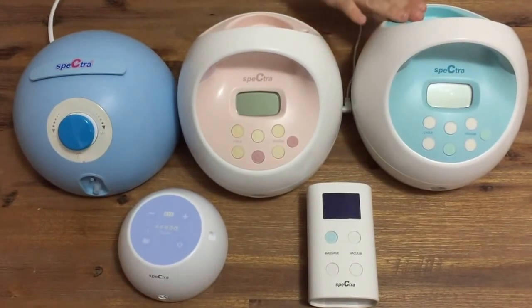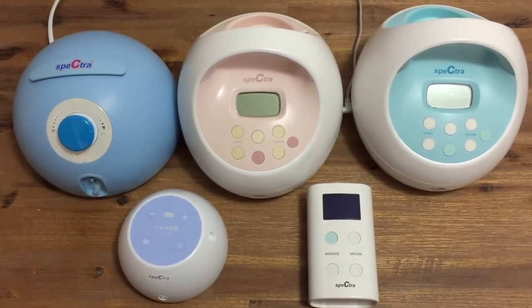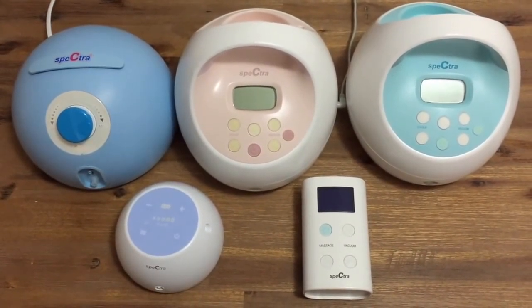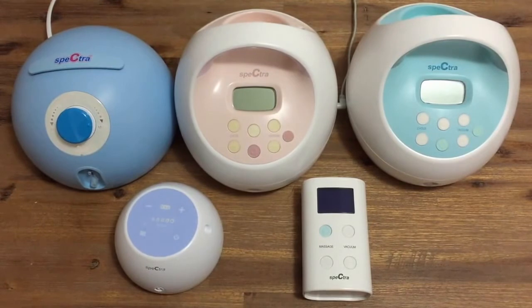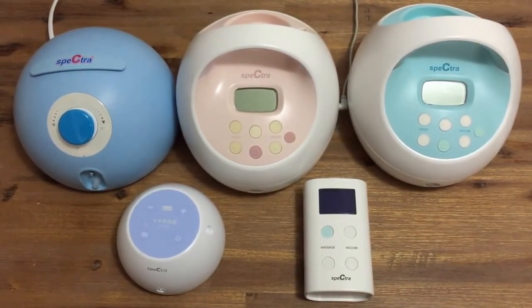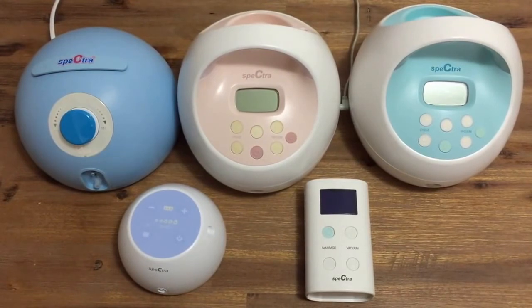After the S2 comes the S1. The S1 has exactly the same functionality as the S2 with the added bonus of an inbuilt rechargeable battery. This is perfect for those who need the strength of a hospital grade breast pump with the added flexibility of a portable pump.